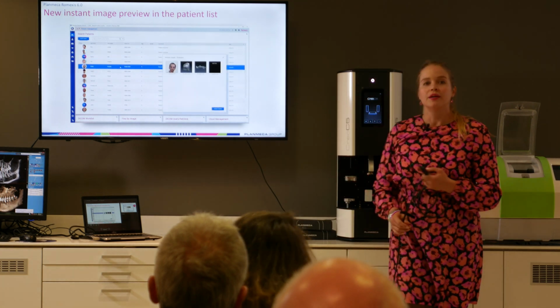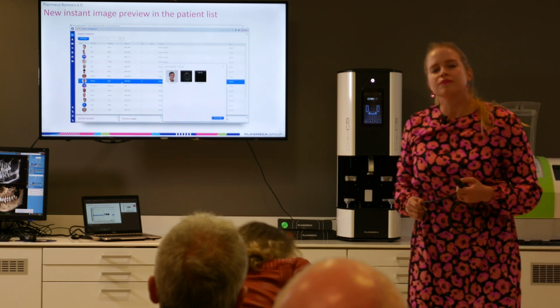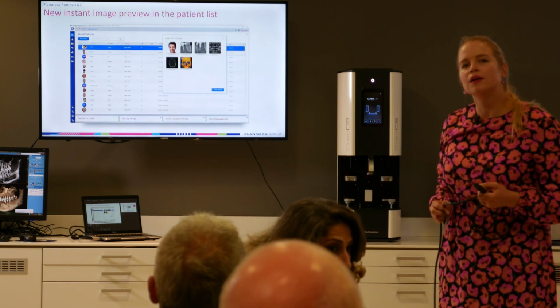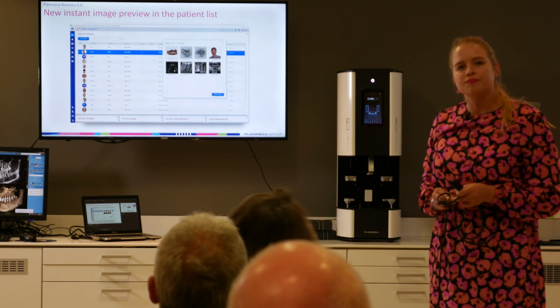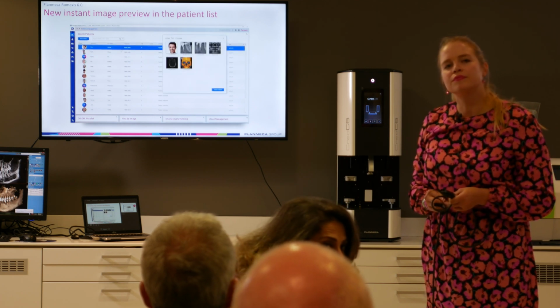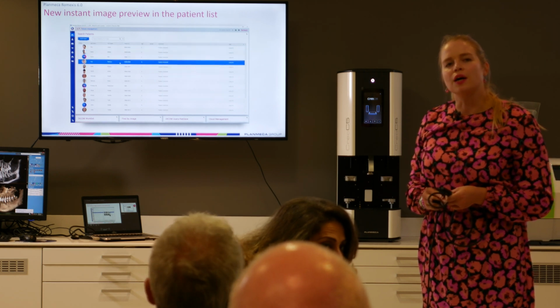Yeah? You know, it looks really beautiful, but the problem is we still have to go between two softwares, one for patient management and one there. Is there anything where we can do a charting and treatment plan everything on one? At the moment, I mean, I use Exact and I use Romexis, right? I can put all this data there and everything. I need to run that and I need to run Exact for my charting and my treatment planning.